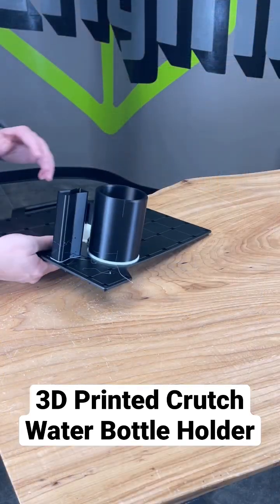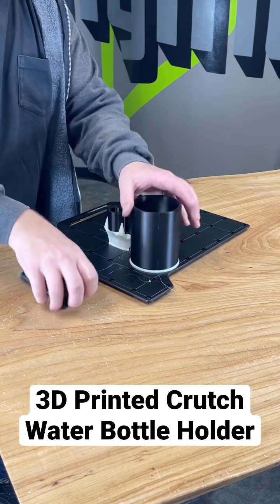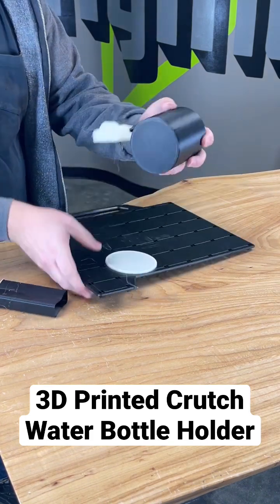With the print completed, we can remove it by bending the build sheet and popping off the piece. We're then going to remove the support and it's ready to use.